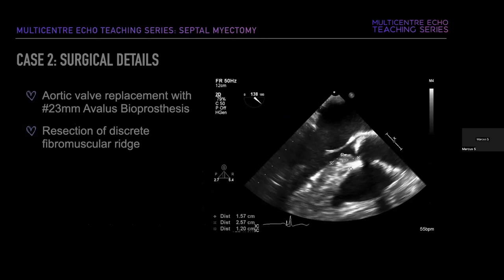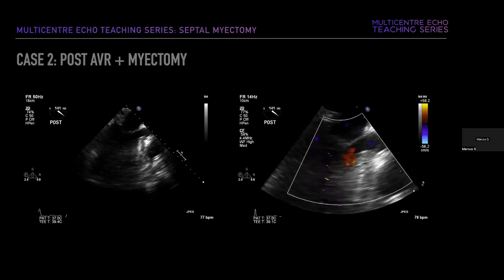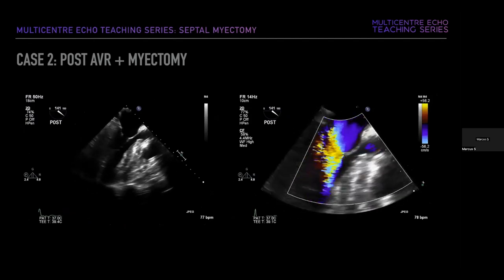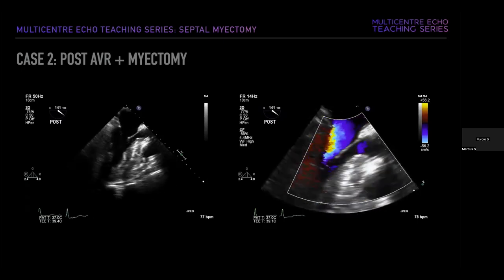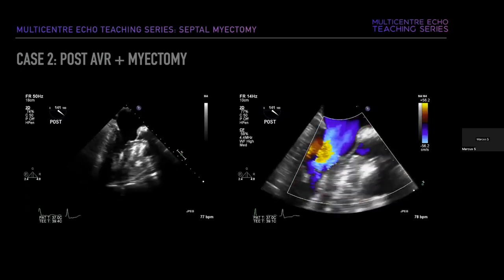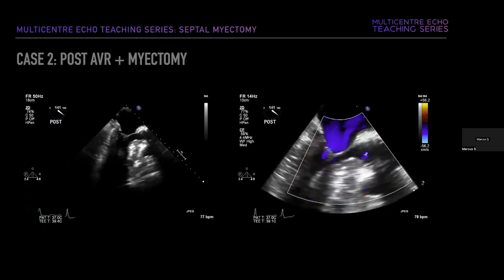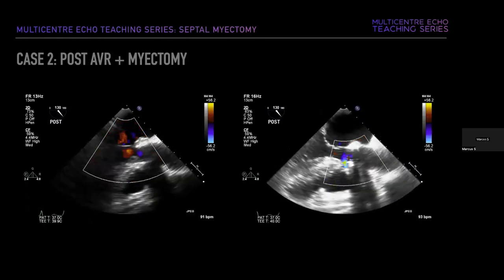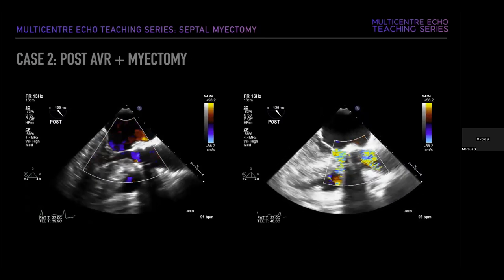The surgery was performed by a non-septomyectomy surgeon as an ad hoc procedure: aortic valve replacement with a 23-millimeter Avalus bioprosthesis, plus resection of the discrete fibromuscular ridge with myectomy. After discontinuation of bypass, repeat assessment showed preserved LV function but unfortunately persistent turbulence through the LVOT despite the aortic valve replacement, along with an additional concerning finding not seen in the preoperative study.